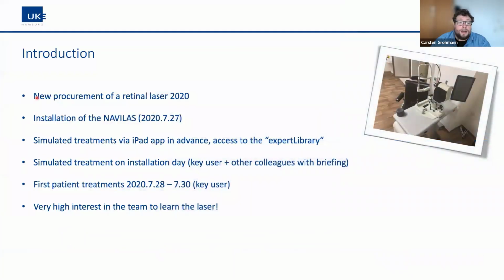For the laser, we have had this laser since July 2020, and for the performance we did here, we had some simulated treatments via the iPad app, and we had access to the expert library from Navilas.